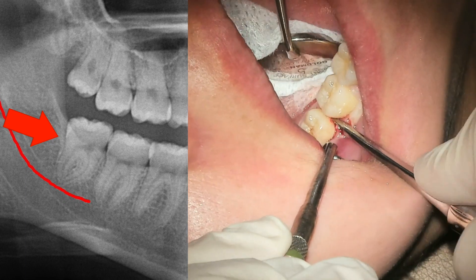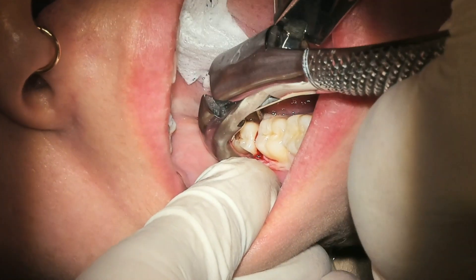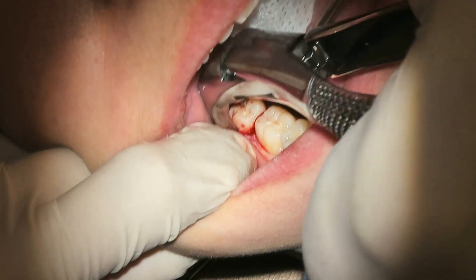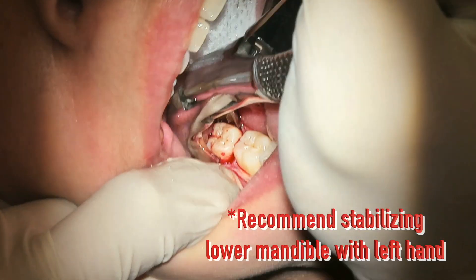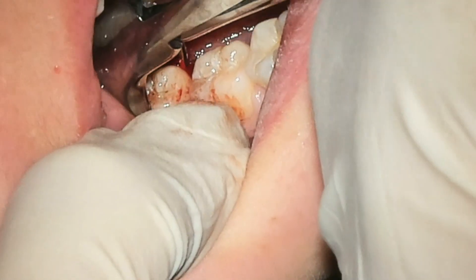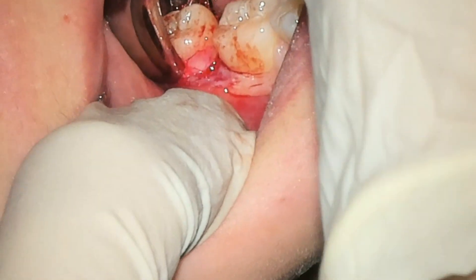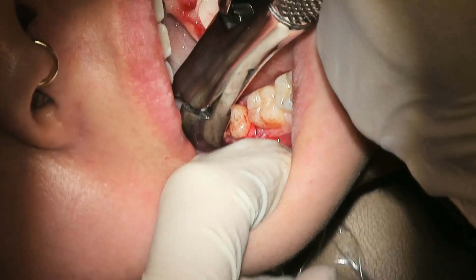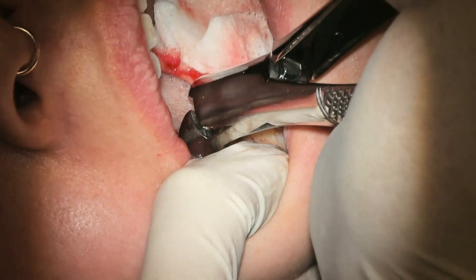So we actually have to go to forceps a little bit sooner than we would like. But as long as you're very judicious with your initial movements with your forceps, you should be able to gain mobility slowly but surely. You can section the tooth, or you can stand from a 12 o'clock position with the forceps in your right hand and use your left hand to stabilize the ridge and the mandible, which is actually recommended. If you stabilize the mandible with your left hand, you can feel the bony expansion with your forefinger and thumb, and you can move the tooth in a way that's not moving the whole head. As you can see here, the whole head is moving whenever I move the forcep — that's because I don't have a good handle on the jaw. The reason I did this position is to get a good visual for the video and talk about the downsides of not having a good hold on the mandible.